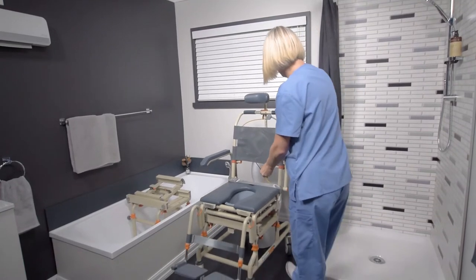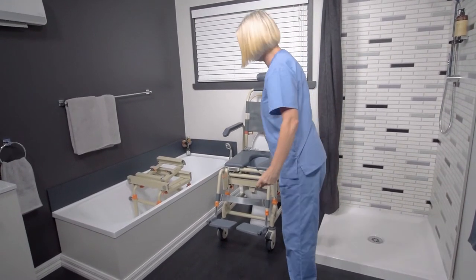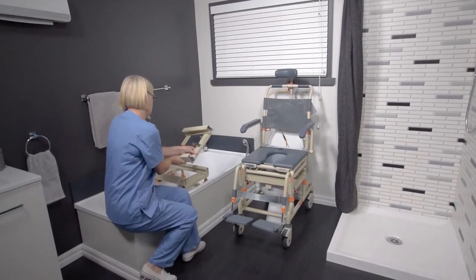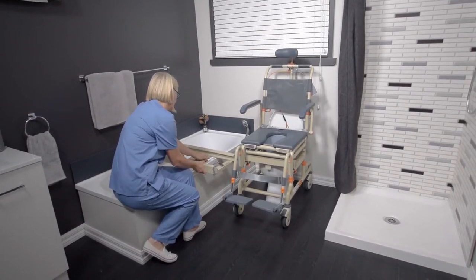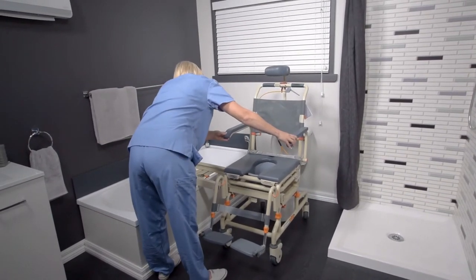Shower Buddy has provided solutions for disabled and elderly to access their home bathroom for over 14 years. Welcome to this tutorial on model SB2T, the Tub Buddy Tilt and how to set it up correctly. There are three major components: the chair, bath base, and bridge which connects these together.